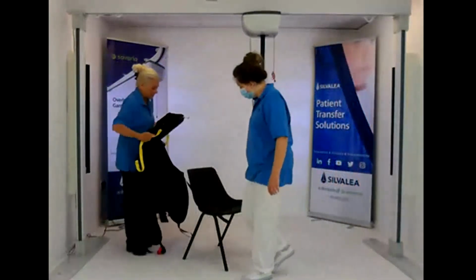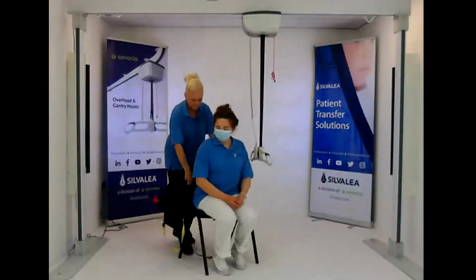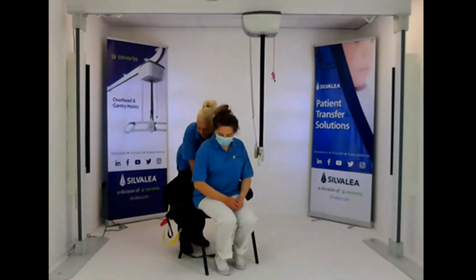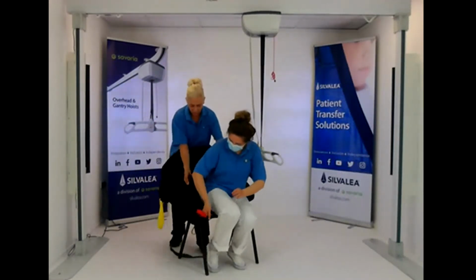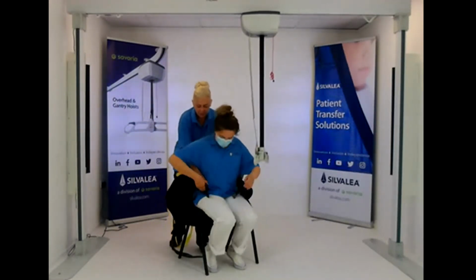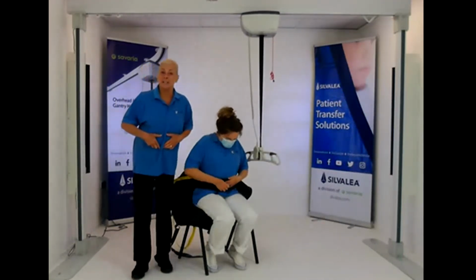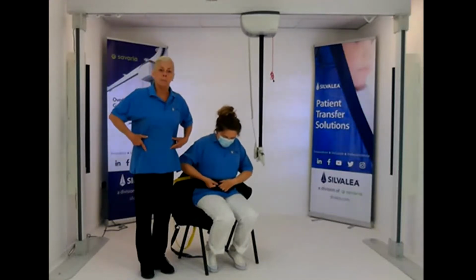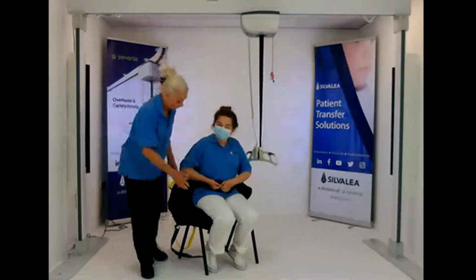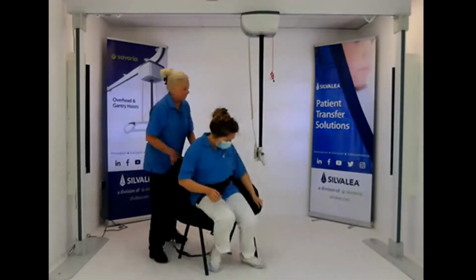I'm going to put it on, Laura. It's a divided leg, so we can get it on in a chair or the bed, of course, because it's got a head support. So we just get it down, and there's a waist support, which if we position the waist support, it helps with knowing where the sling position is, because if it's fitted up here, it's too high. So then once you've got that in, we know that it's at the right position.